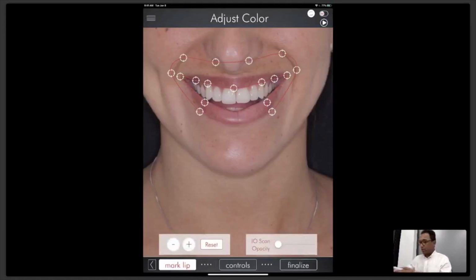Sure. So before we continue, I have a question. So Mont, yes, you can rewatch this webinar. We'll be sending the link to you. Now, Sindhu, the CAD software that your lab uses, that has the same shapes that we have here, is exocad. E-X-O-C-A-D, exocad.